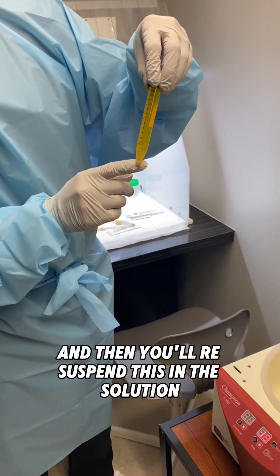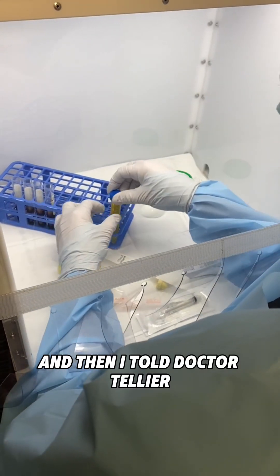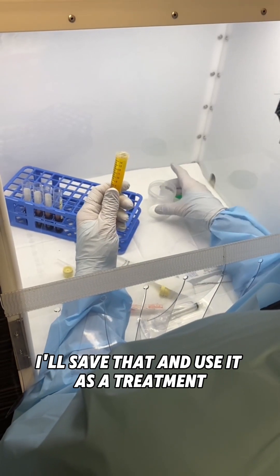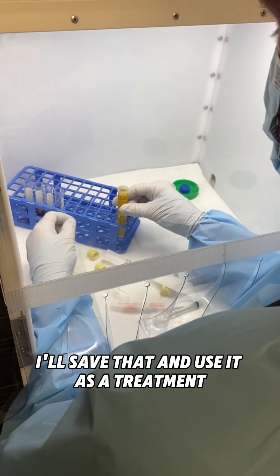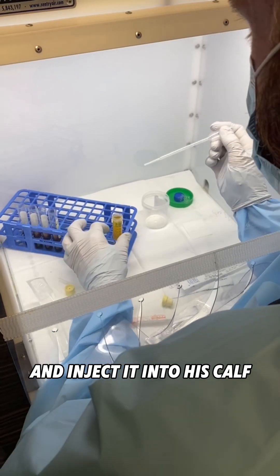With the tall tube I'm going to discard all of the supernatant and then save the pellet, re-suspend it in the solution. I also told Dr. Tellier — sometimes I save the platelet-poor plasma; if I'm doing hair I'll save that and use it as a treatment. I think it's probably a great idea for him to inject it into his calf as well.